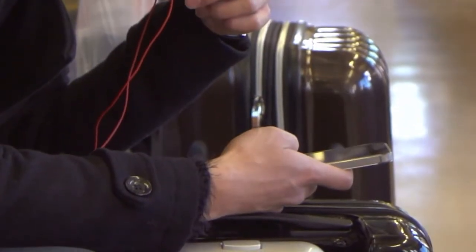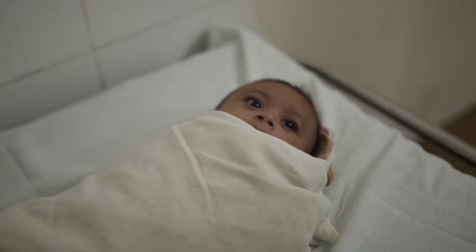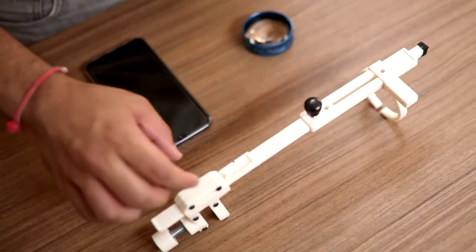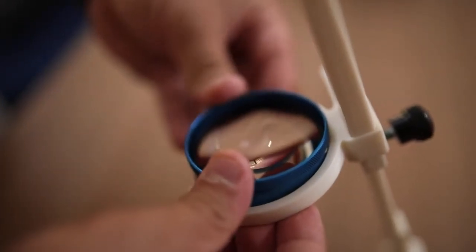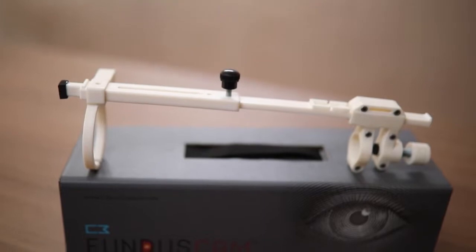By leveraging the growing smartphone technology, C3 has been able to develop this portable and inexpensive device, which can be carried to resource-limited areas to conduct ROP screening. With this device, we will enable ophthalmologists and optometrists to conduct basic ROP screening without the requirement of expensive and bulky equipment. Our device is compatible with major smartphones — iOS and Android — and major indirect lenses like 20D, 28D, and 30D. The device is very intuitive, easy to use, and requires very minimal training.